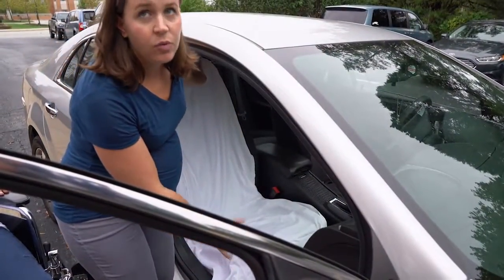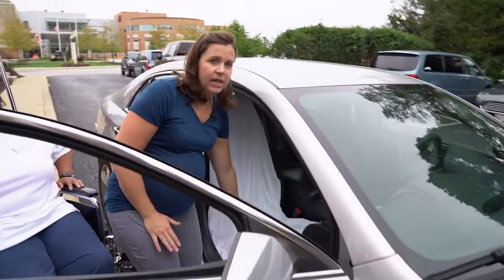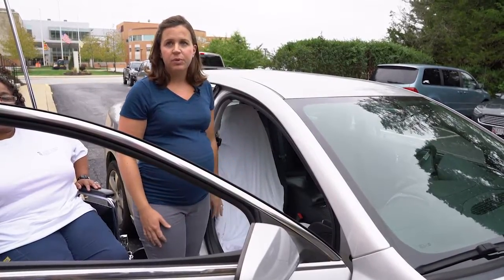Put the seat all the way back before the patient gets into the vehicle. Sometimes I like to put a sheet or a blanket on the seat itself. You can use that to help move the patient into the car and position properly.